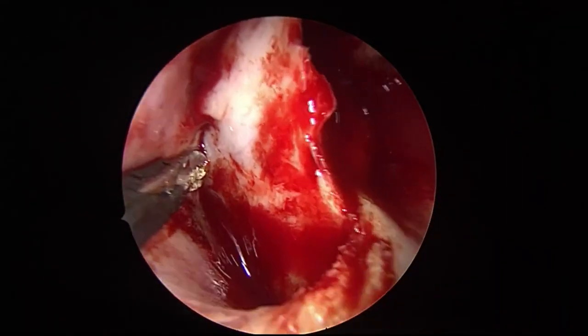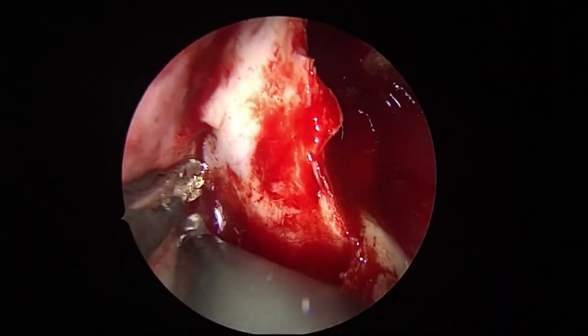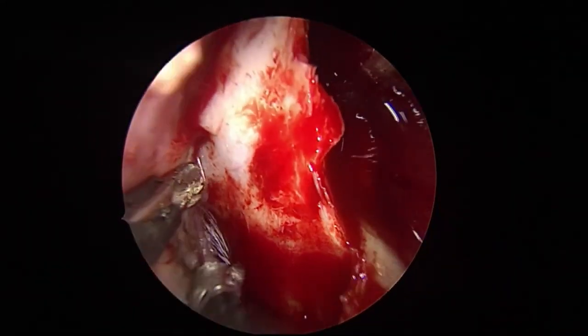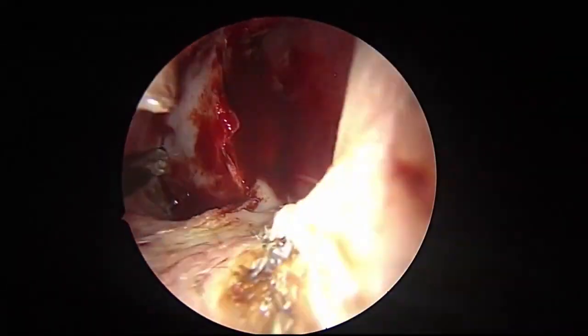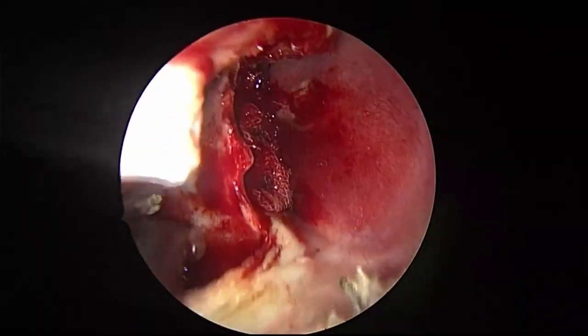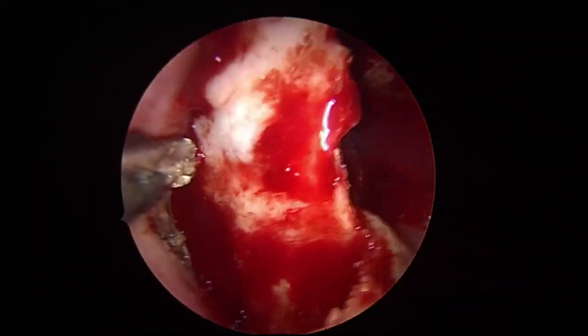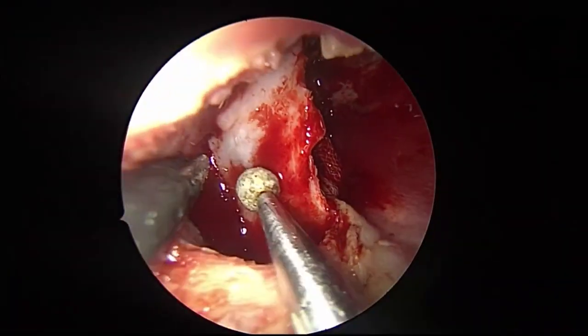See some periosteal ooze. Never mind. Now see what I'll do. I will enter into the maxillary sinus and show you what is the level of the roof.